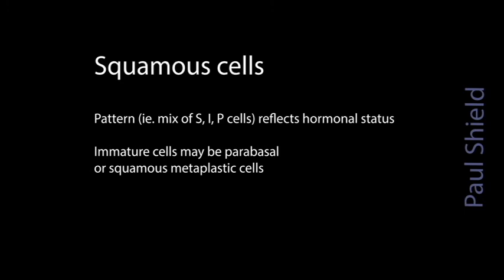Immature cells, in addition, are not just derived from the lower third of the stratified squamous epithelium, but as I'll point out next time, are present in areas of squamous metaplasia also.